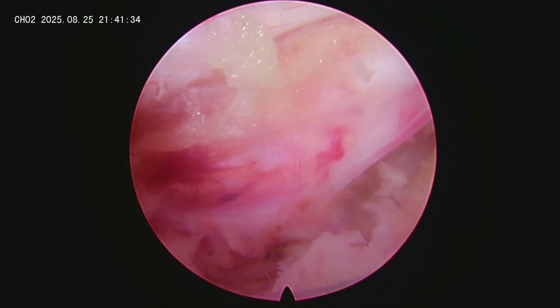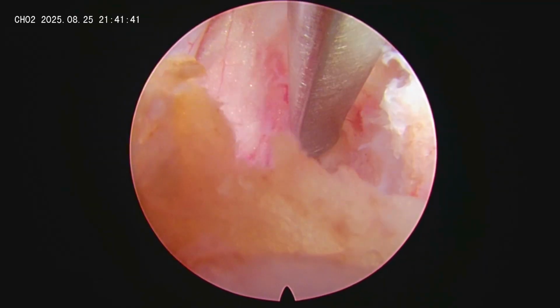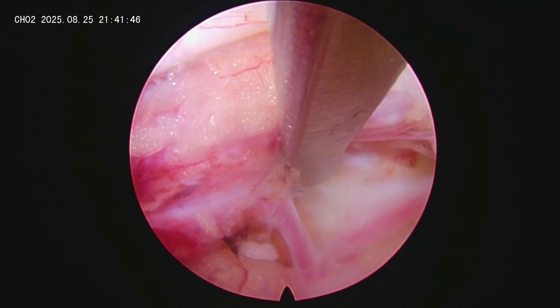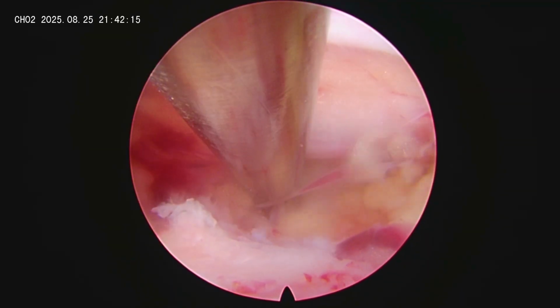Here you can see that there is an epidural vessel running from the lateral border of the traversing root into the lateral recess. This particular vessel is not allowing the traversing nerve root to move, thereby reducing the mobility of the root. That means the same vessel which is responsible for the congestion of the traversing root is also causing the root to become fixed. I freed the traversing nerve root by cutting the adherent epidural vessel, but the question is, can it be the cause of disproportionate pain in this particular patient?